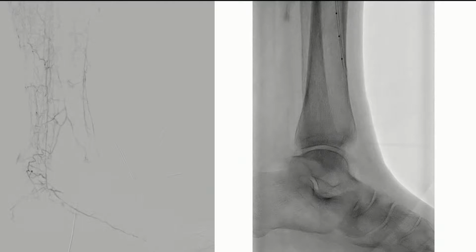Or what we do most commonly is attempt to use some type of a balloon to take an artery that may be occluded or completely closed down or narrowed, and to open it up to try to get more blood supply. And what are we looking at, Dr. Powell? So what we're looking at is actually an interesting story.